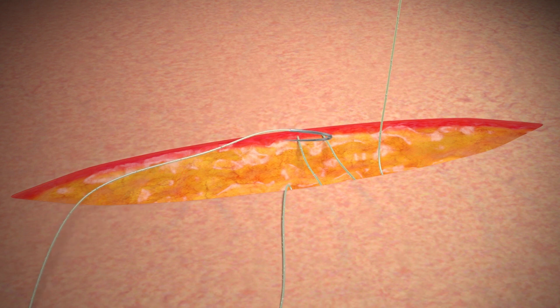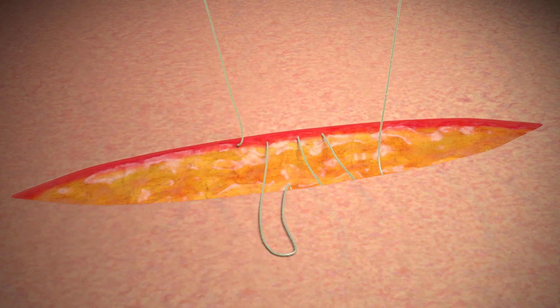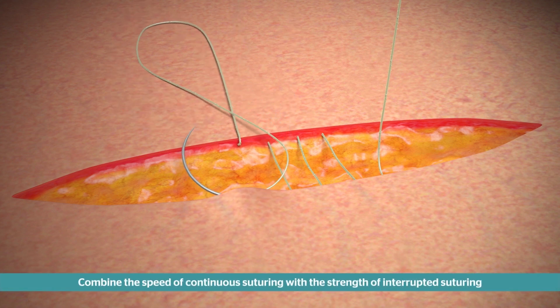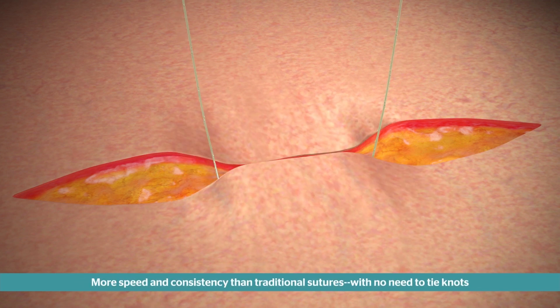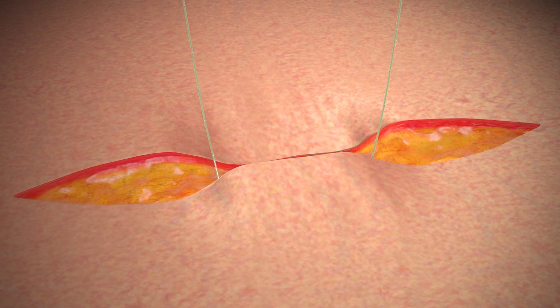The bi-directional design allows two healthcare providers to close simultaneously, with no need to follow the suture line, for greater efficiency compared to traditional suturing techniques. Initiation of closure in the middle allows tension on the suture to be maintained on each pass without knots, eliminating knot-related complications. This also allows for better control in non-linear and large open wounds.